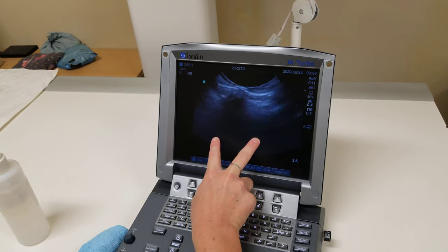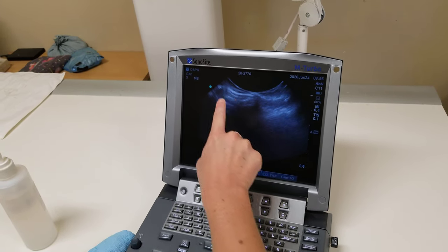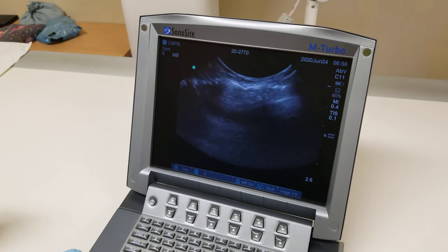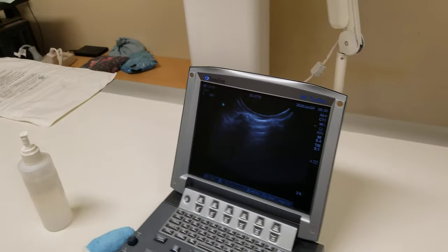The two rib heads should shadow down because ultrasound doesn't go through bone. In normal lung, you'll see parallel bright lines called A lines going between the two rib spaces. We're going to start with that rib space, starting dorsally near the spine and scanning ventrally.